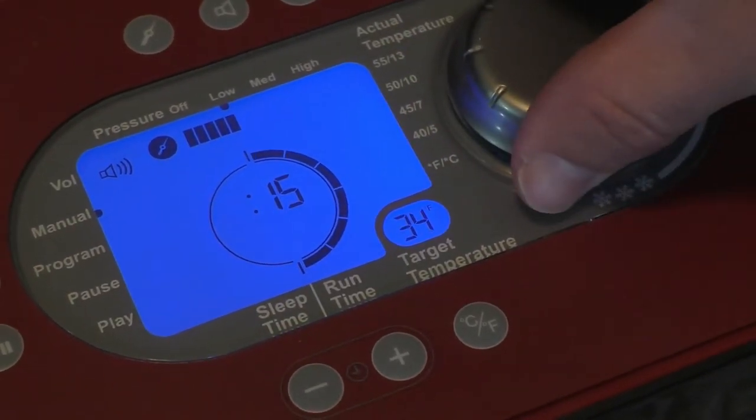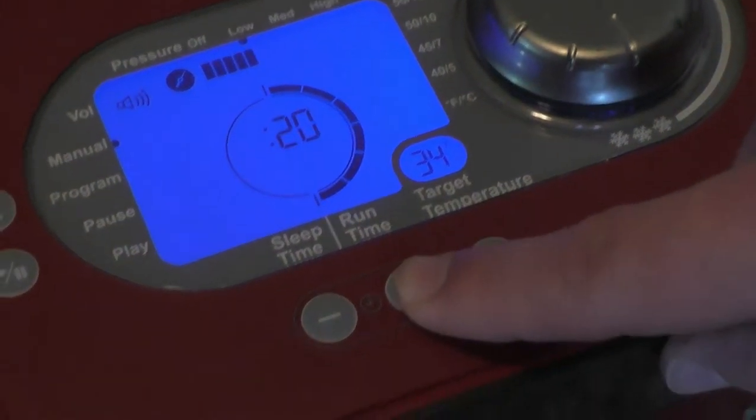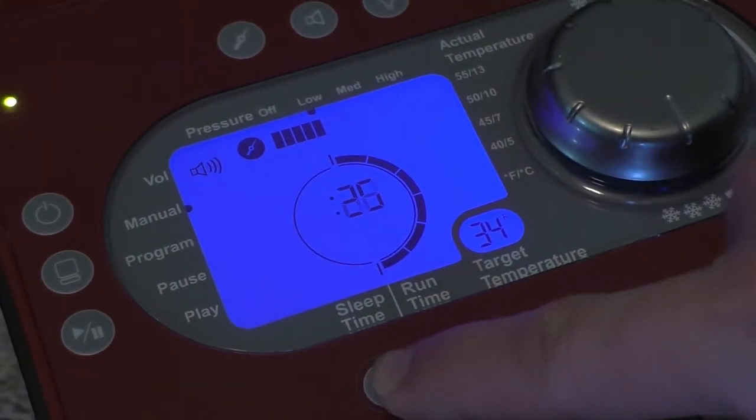By turning the knob, you can control the temperature. Next to that are the plus and minus buttons, which control how long you want the machine to operate.